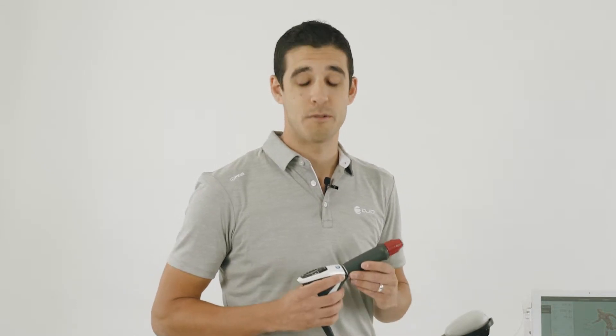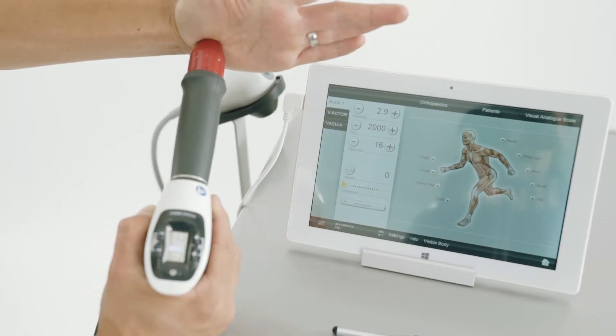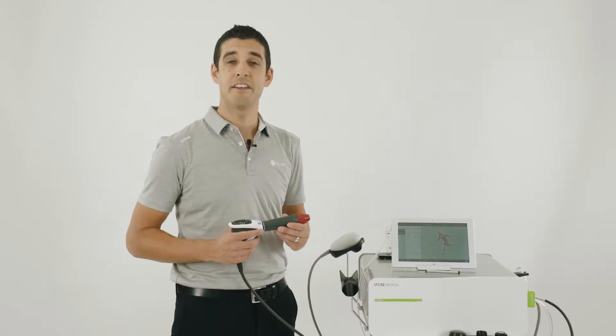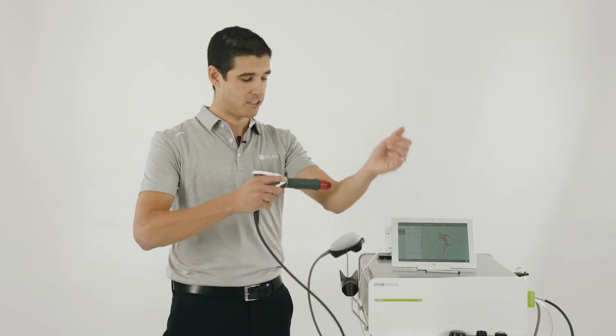One of the unique features of the Stortz Medical Falcon handpiece is the skin touch feature. This allows you to measure the contact intensity, which is how much pressure is applied to the patient. The contact intensity can be viewed on the handpiece or on the tablet. The other feature of the skin touch allows you to start the treatment when you put pressure on the patient, like so.